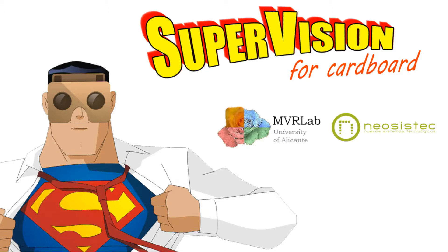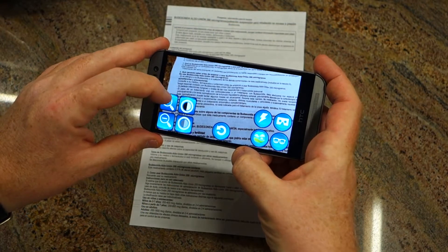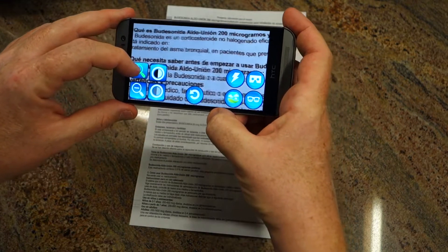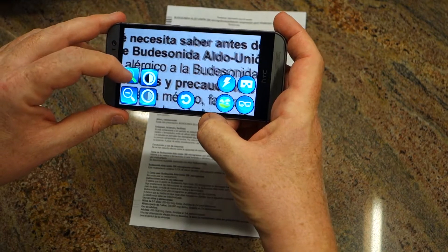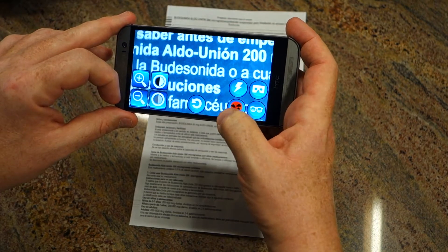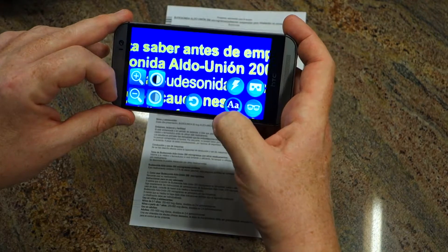SuperVision is an advanced magnifier for the visually impaired based on Google Cardboard. You can use it without a cardboard unit, converting your smartphone into a portable electronic magnifier. The application allows you to easily control the zoom, the contrast, and the color mode of the image. Three natural and six synthetical color models are supported.